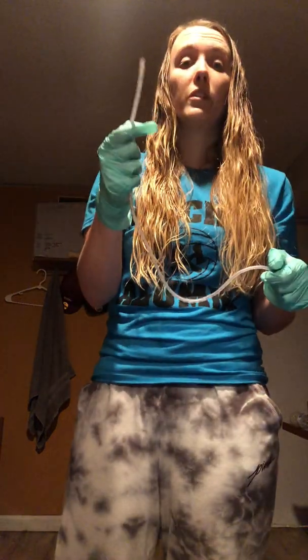Once I have my catheter in my hands, I'm going to measure how far we're going to insert this. Keep in mind that you're going to keep this sterile while you're doing this.